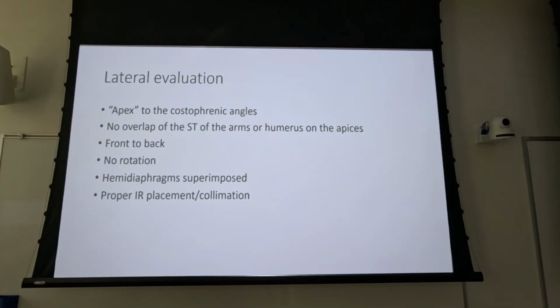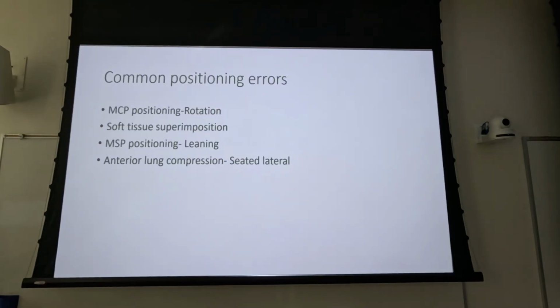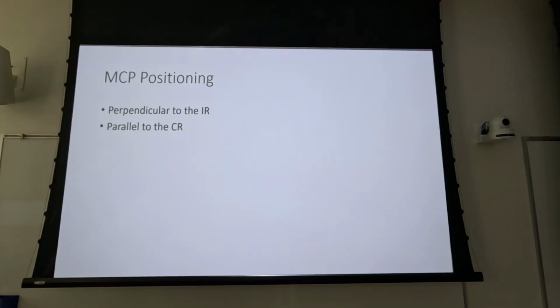Like, this gets into the next portion of this, but let's say you shoot a KUB on a patient and you miss the B. Do you need to go back in and shoot a whole new KUB? No. The answer is no. Bladder shot's going to be fine, right? So, common mispositioning errors, we already talked about all that, so we're not going to go back into it.